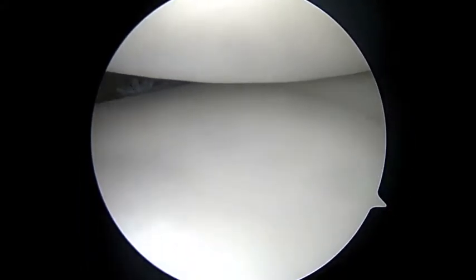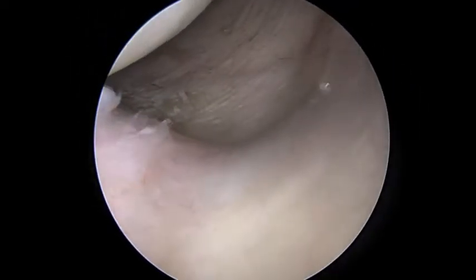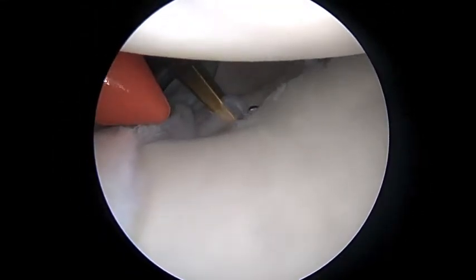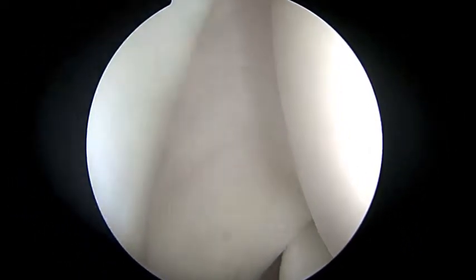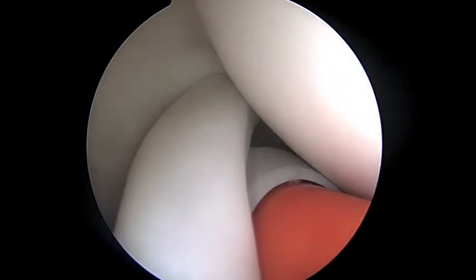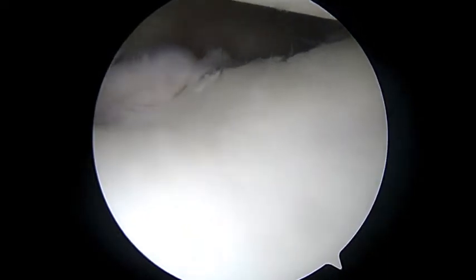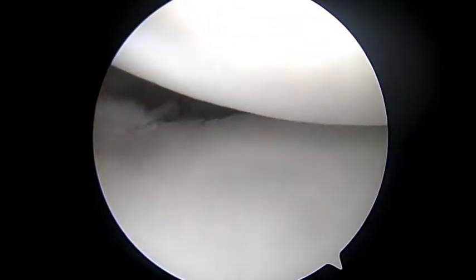As you come to the back of the shoulder, you can see the labrum, but it's certainly torn there. And this posterior capsule is quite loose as well. So we're going to be placing anchors basically everywhere because the labrum is damaged circumferentially. A bit of good news is that the rotator cuff looks fine. No sign of any problems with the rotator cuff. I don't see any significant bone loss on the glenoid, which is something we have to assess — your glenoid looks reasonably intact.